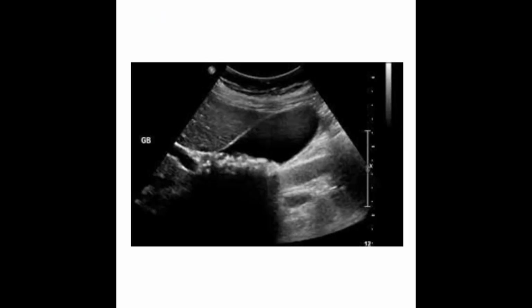Here's an example of a gallbladder with gallstones in it. Gallstones are highly attenuating structures. So as the sound comes into the body, it's going to interact and send back all these echoes, doing a great job, except for when it interacts with these highly attenuating structures. Sound interacts with the gallstones and is either absorbed or completely reflected or scattered, any one of our attenuation factors. And that leaves no more sound energy to produce what is occurring behind the gallstones.